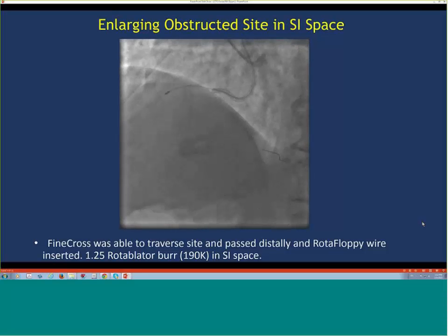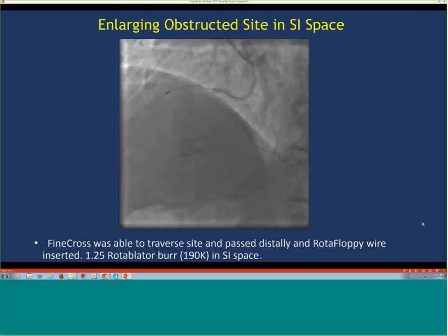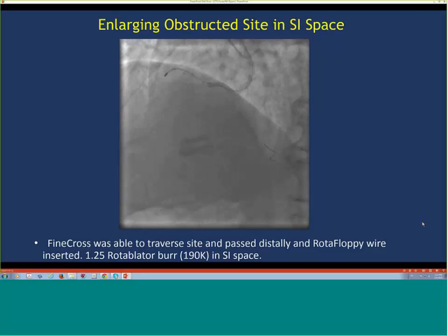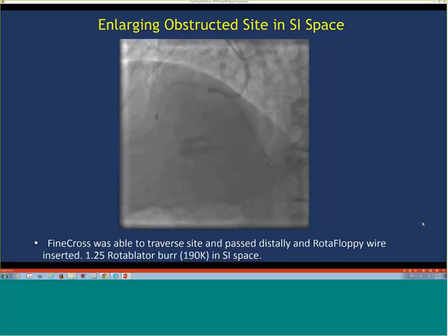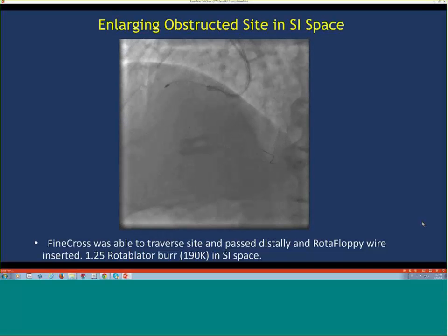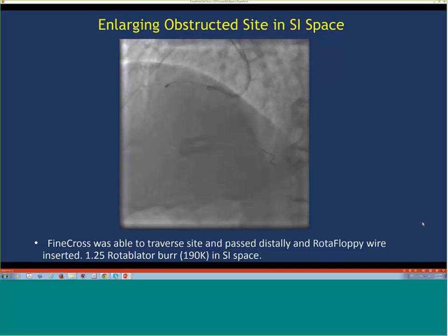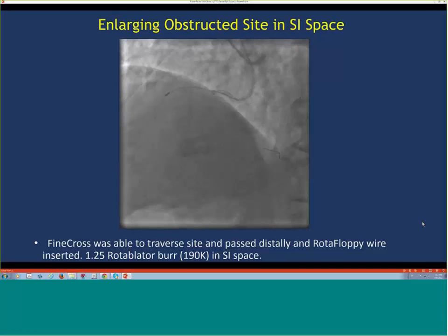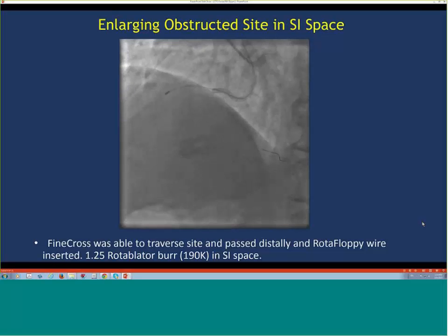I had never done this before. This is why it's interesting to me, because I had heard about it from several operators, but just had some anxiety about doing it. It was a new thing, but it worked very well. It moved very easily. There was a little resistance at the place that we couldn't get through, but once we got through, this is sort of what you might call a polishing run.